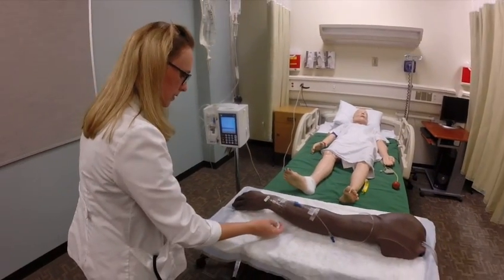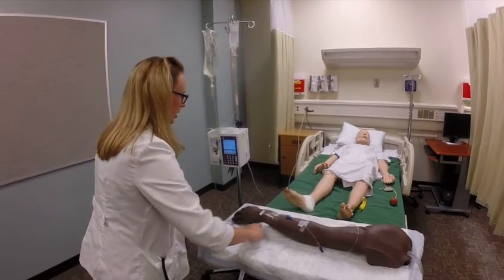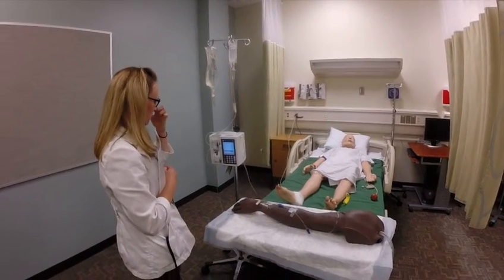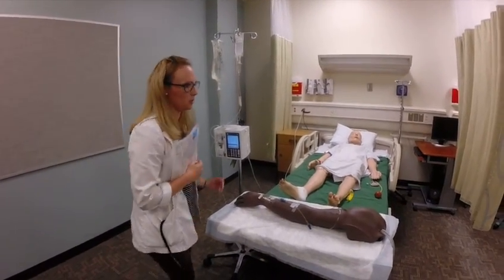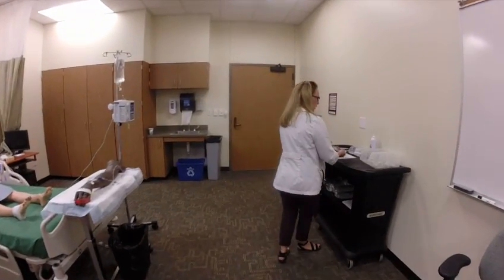Alright, Ms. Imahurt, I'm finished. Your antibiotics are going. I'll be back in about an hour to check on you. If you need anything before then, just let me know. I'm going to go wash my hands. That's it.